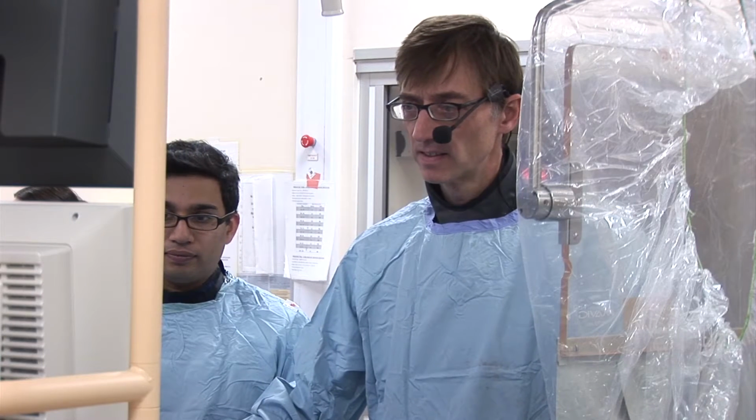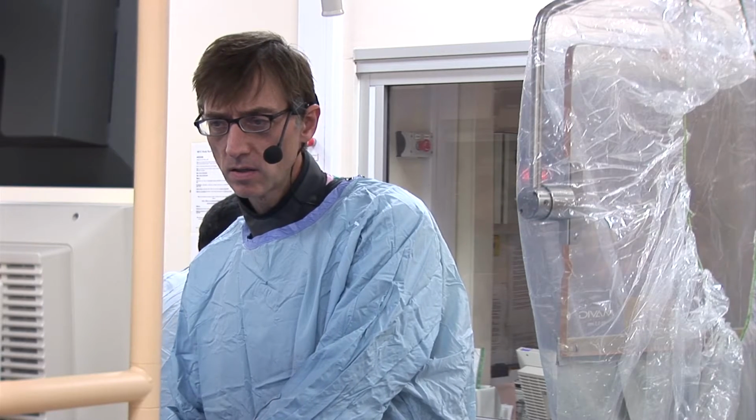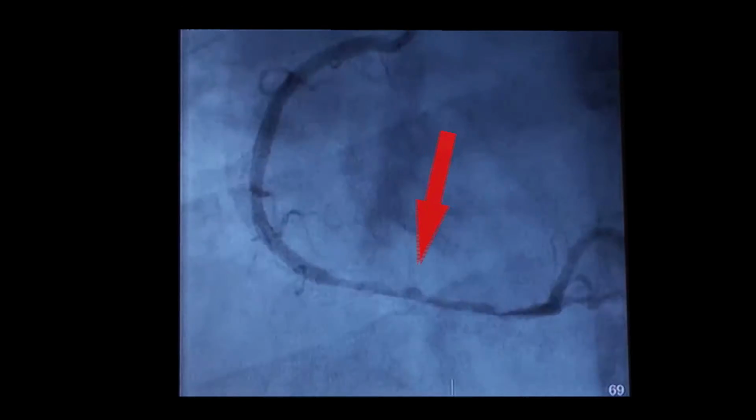and scaffolds the artery. A second stent is implanted in a more proximal position. This is now dilated, opening up the stent struts and again scaffolding this part of the artery. For the first time, forward or anterograde flow is restored into the artery and allows visualization of the more distal vessel.